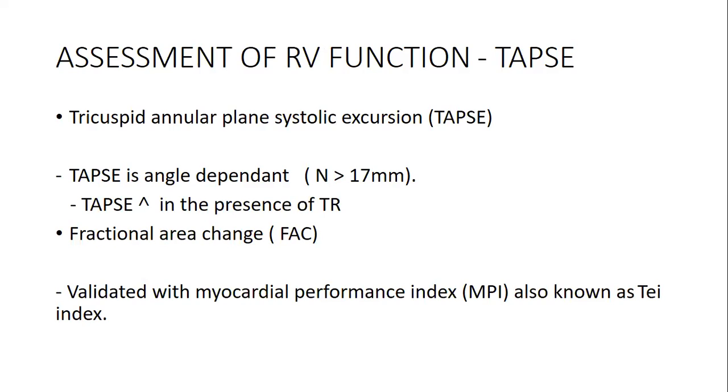And when it comes to the assessment of the right ventricle function, like I mentioned in my preamble, there are quite a number of methods that are done to quantify the right ventricle function. But for the sake of the discussion and simplicity, I'll just discuss one method and comment on a few things. I should mention here that when we are writing our reports in echo, we mention that the left ventricle function is this, and this, and this.